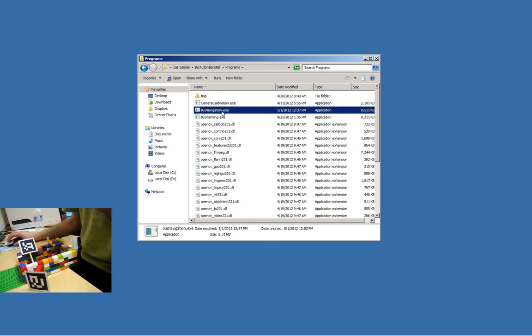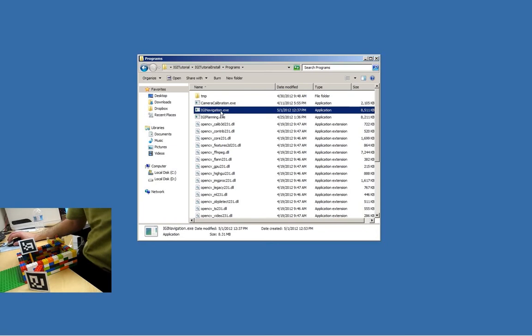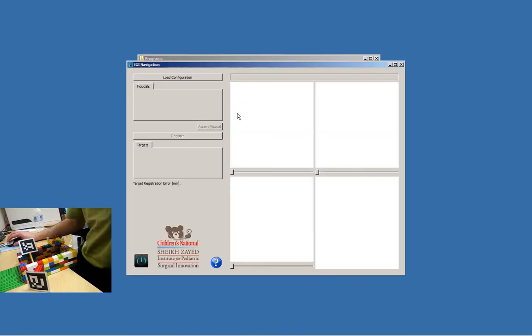Welcome to our last installment of the image guided interventions tutorial. This time we'll be talking about navigation. We assume that we already calibrated our camera, calibrated our pointer tool, did our planning, and now it's time to navigate, so select the navigation program.